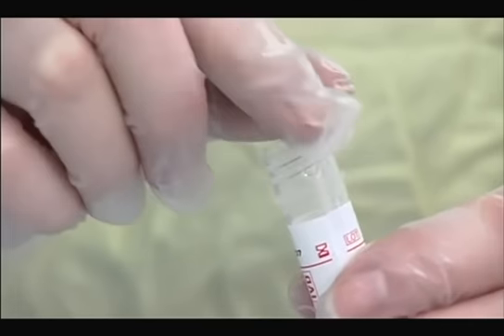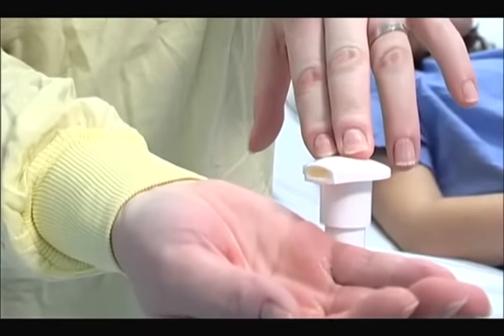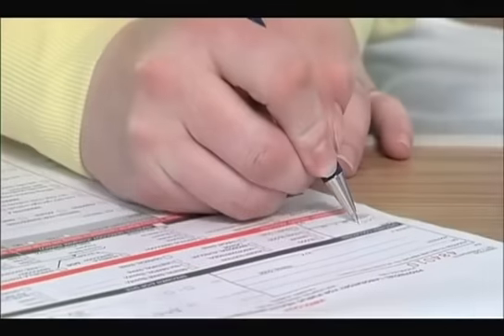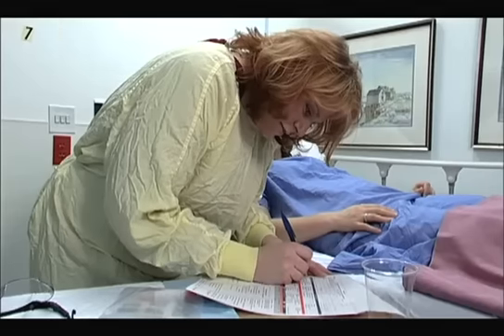Snap the swab shaft into the transport medium at the score line, then cap the container. Then remove your protective equipment and perform hand hygiene. Complete the labeling of the sample and requisition prior to sending it to the laboratory for testing.